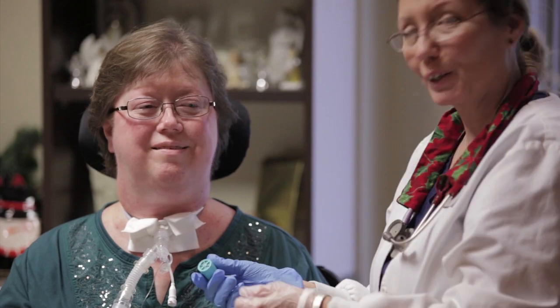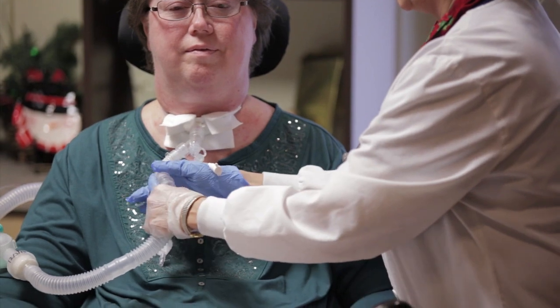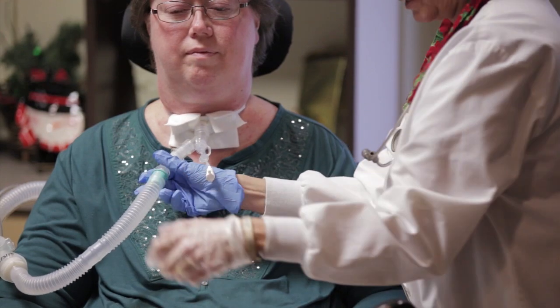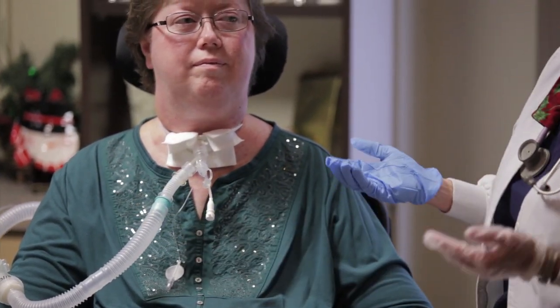Should we try it? Are you ready? Here we go — I'm going to take out this piece and place this valve in. It's an aquamarine color, meant especially to go into ventilator tubing — it just fits right in. The first couple of breaths might feel a little different, but your soft whispering voice may now disappear and you're actually going to find more strength. Your voice is a lot clearer. Is that correct?